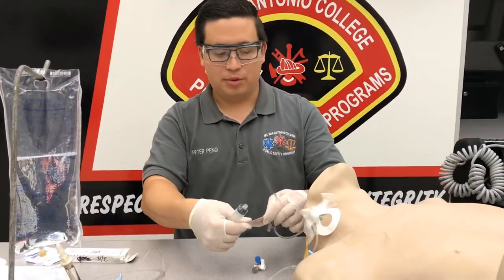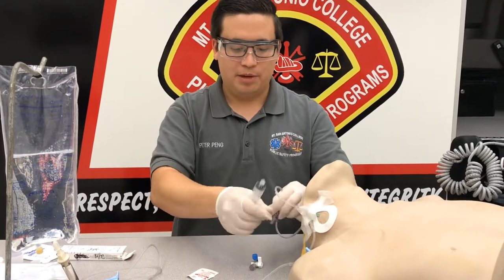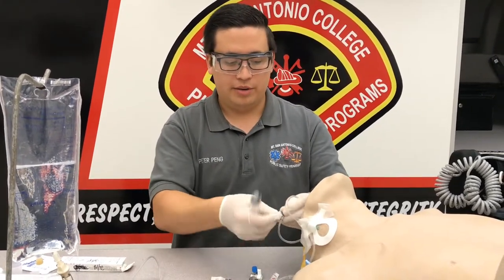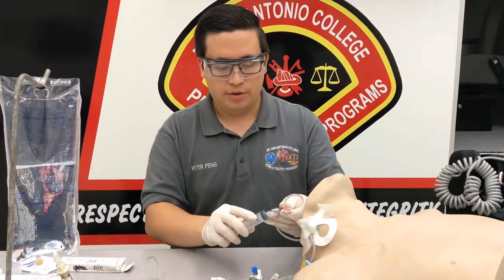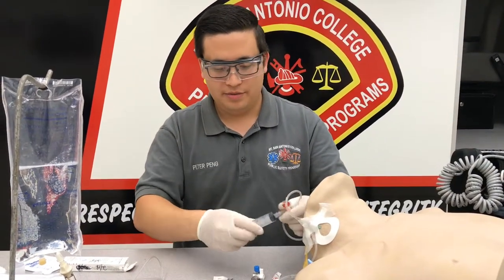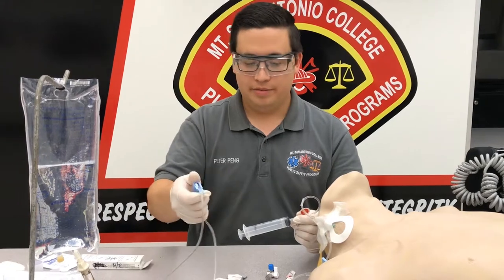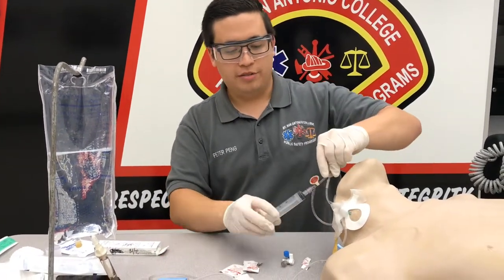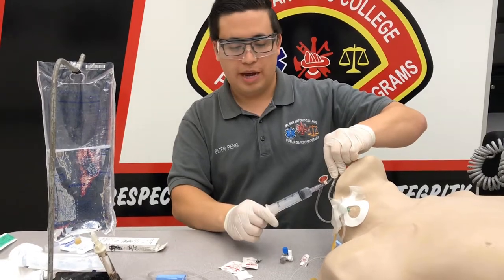We're going to clean off our port — open up an alcohol prep pad, make sure you clean that well — and we're going to withdraw 20 mLs. Open up your IV line, you're going to pinch above, and you're withdrawing from the bag itself.